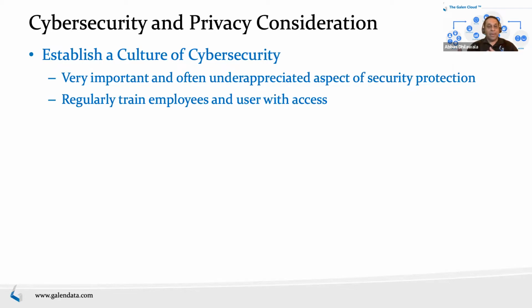And so if you frame it differently, it's important that people appreciate the importance of healthcare records, healthcare data, access to the devices, device access to data from the devices, and the functions on those devices, that there needs to be security in there. So a lot of that cybersecurity culture also should permeate into your user guides, into your marketing materials, into just general education.